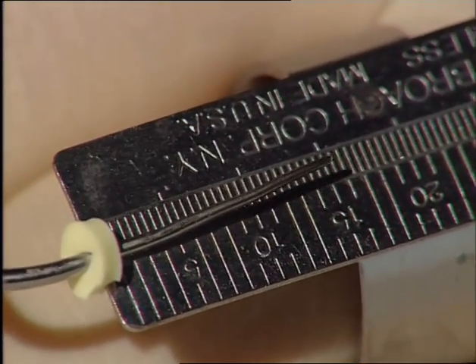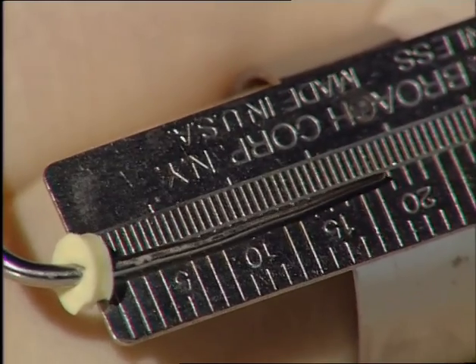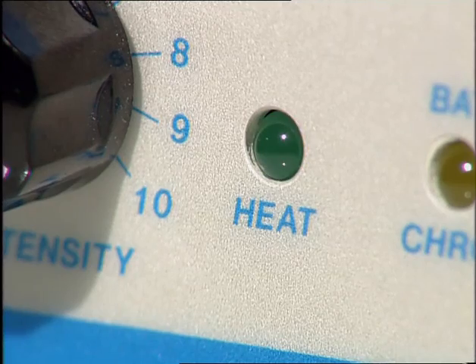A rubber stop is placed on the heat carrier of the Touch 'n Heat instrument so that it will be worked to within 5 to 7 millimeters from the canal terminus. The useless portion of the cone is removed at the orifice level.